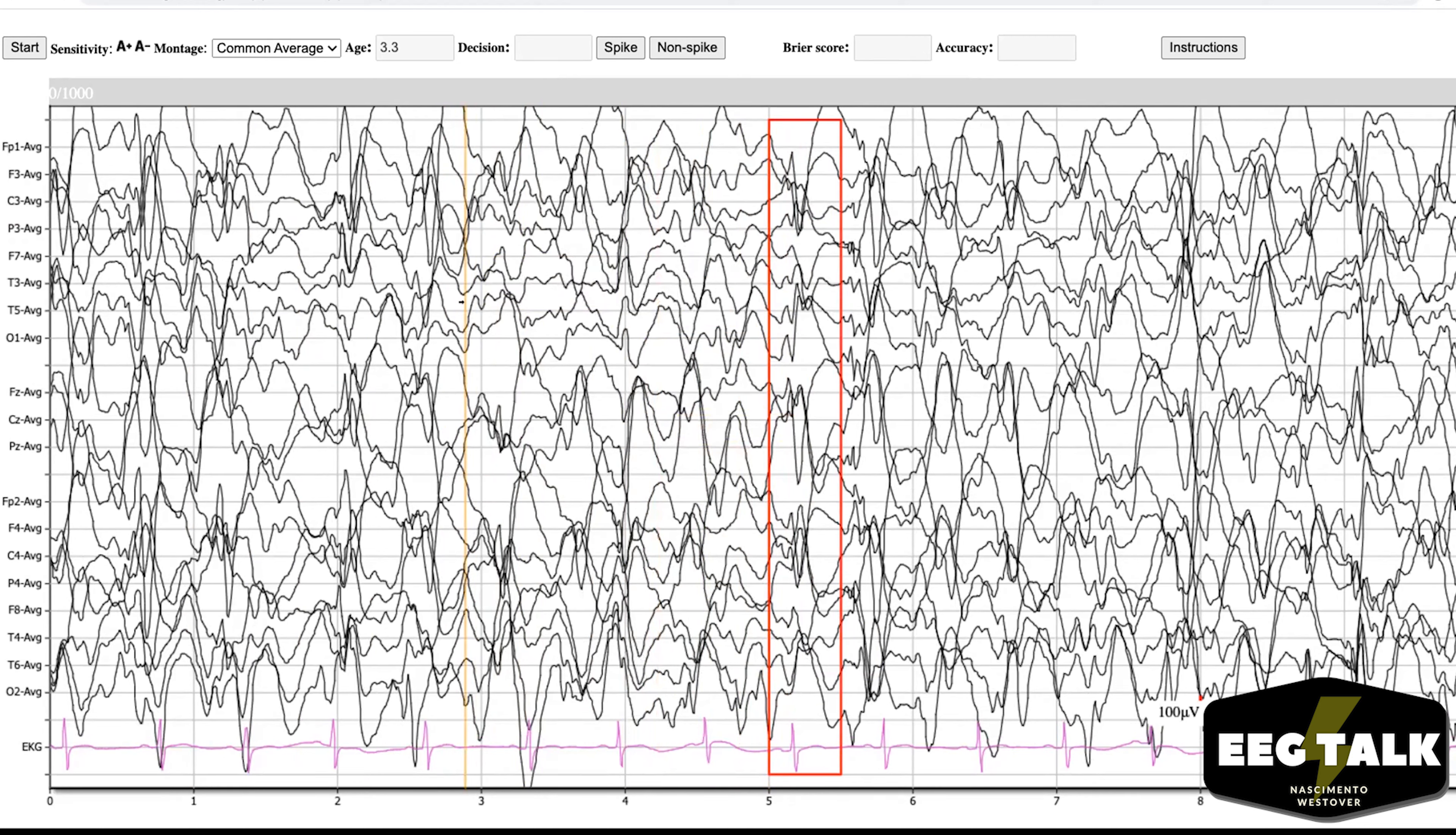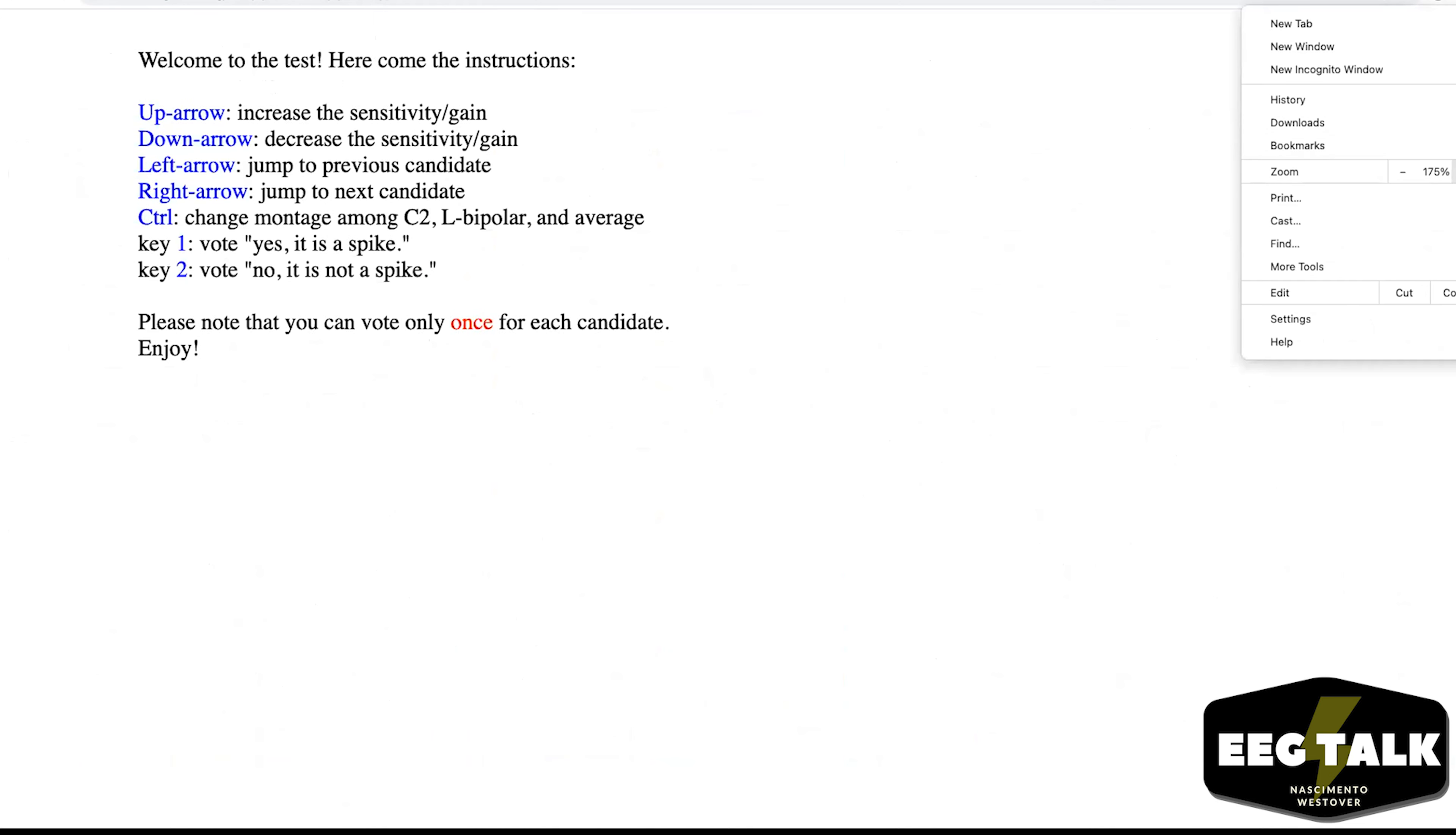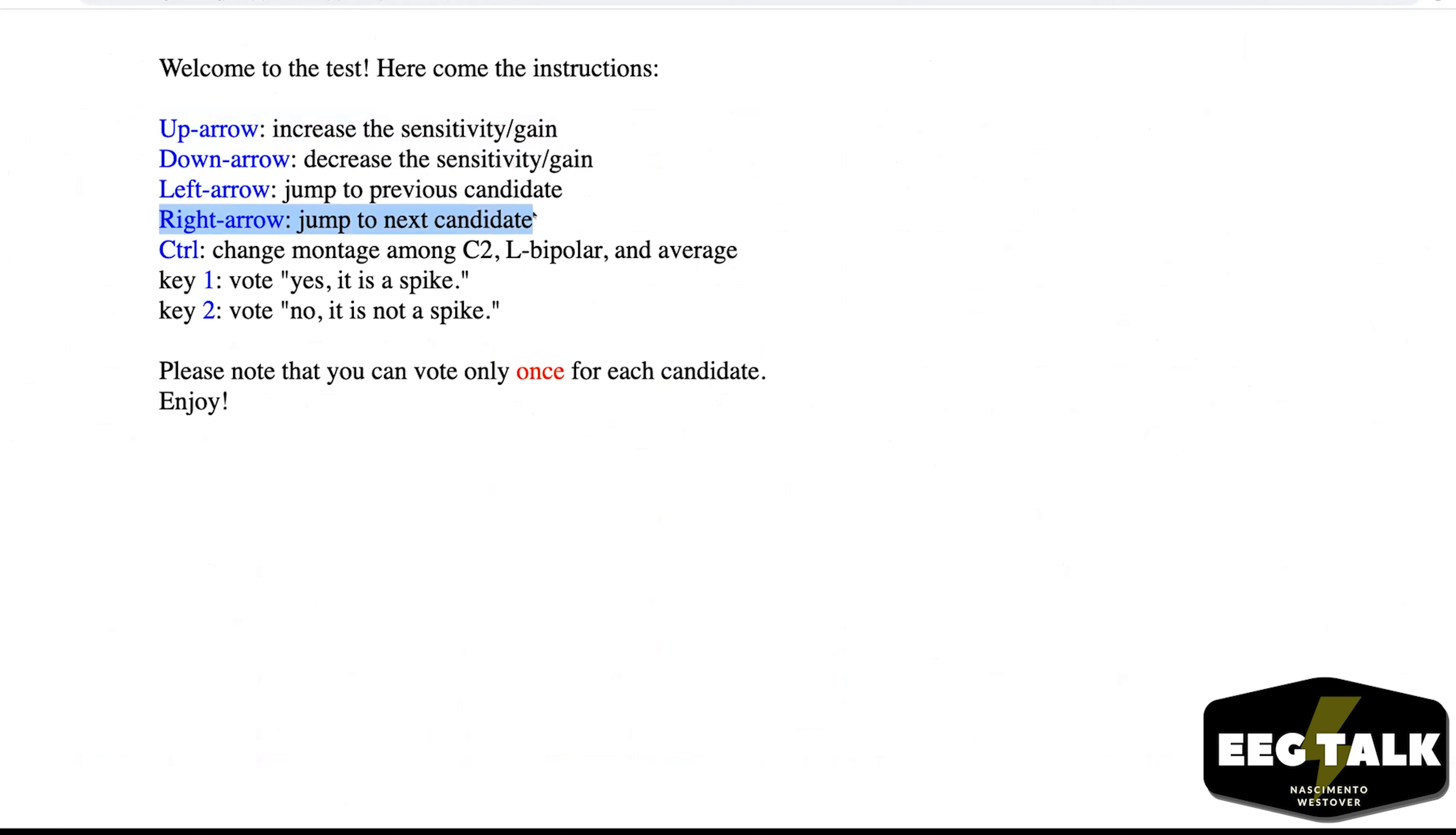Yeah, in the instructions it will show you how the buttons work. We have shortcuts like using the up-down arrow to change the gain. In the direction, you can go left or right to go to the previous or next candidate using the arrow keys as well.